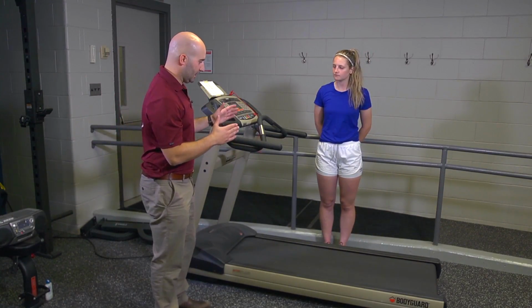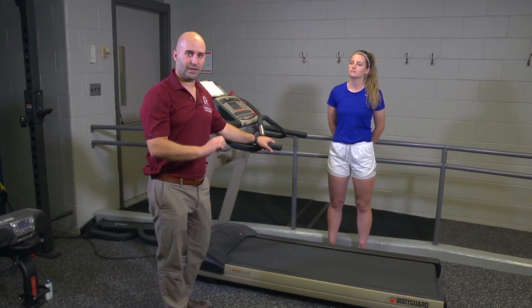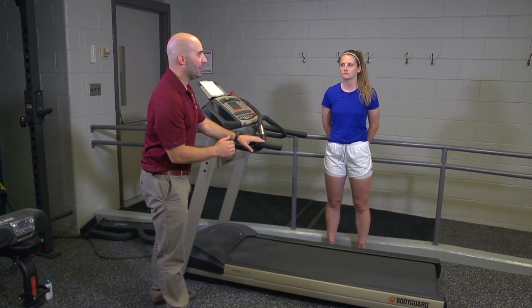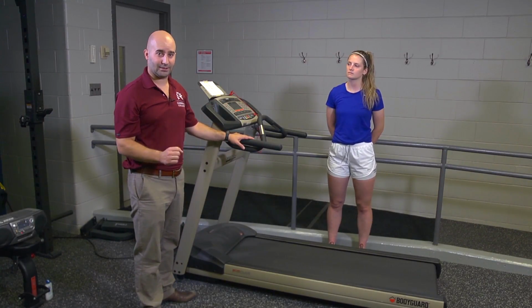So without any further delay, this is a 2-stage test. Both 4 minutes. The first stage acts as a warm-up. The second stage is really the working load of the test. Walking throughout, I'm going to be selecting a speed as the tester between 3.4 and 4 miles an hour.